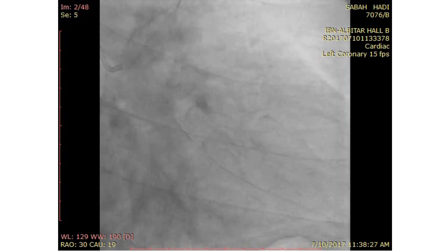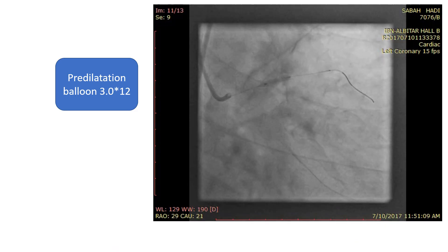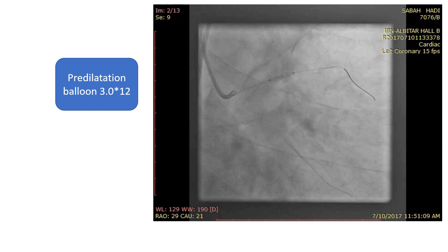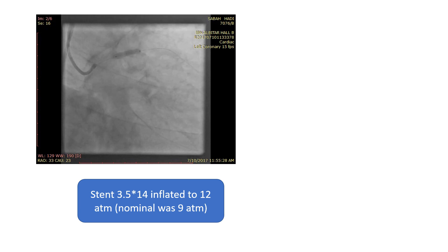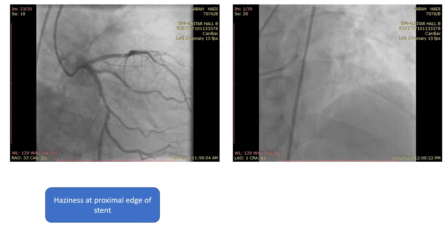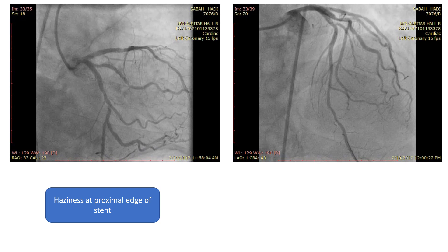We went ahead for PCI, pre-dilated with a balloon 3.0 by 12, and then used a stent 3.5 by 14, inflated to 12 atm — the nominal was 9 atm.